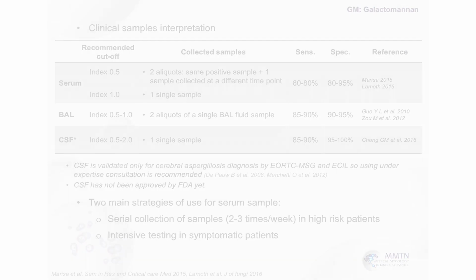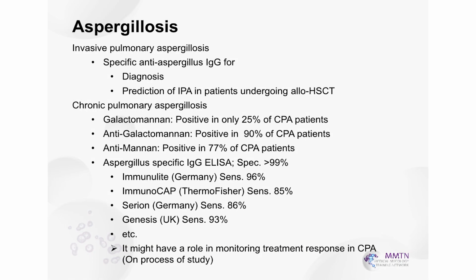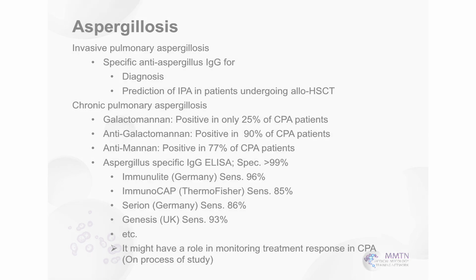Okay. So for aspergillosis, you have a specific IgG and so on. Galactomannan. So they try to be specific for the individual patient and not only the EIA. Now they have many companies that try to produce more. Still in process too.